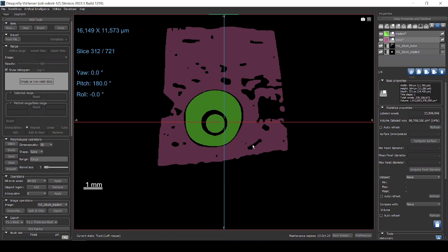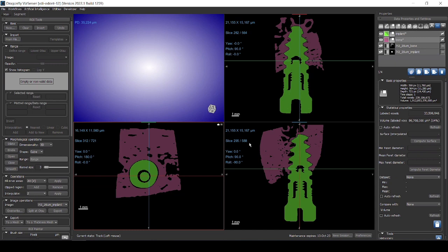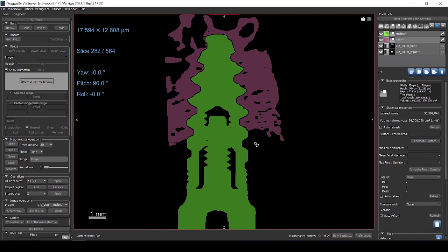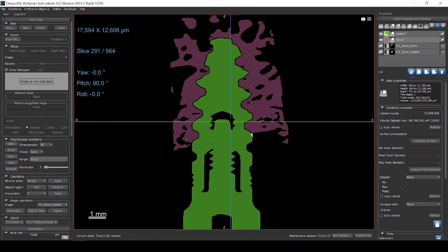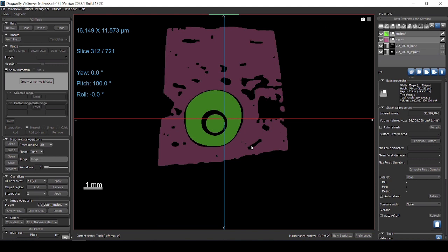So that's how it looks like. You can clearly see that inside the implant we have a gap. That's the design of the implant. That can be an issue when we're doing the calculation of the distance. But I'm going to show you how to go over it. So this is a better view. We want to calculate how much bone has grown around this implant, and in this case it looks quite nice. There is quite a lot of bone that is in near contact with the implant.